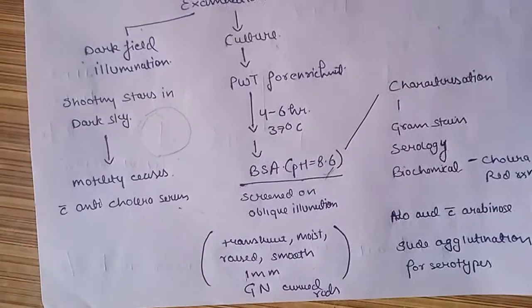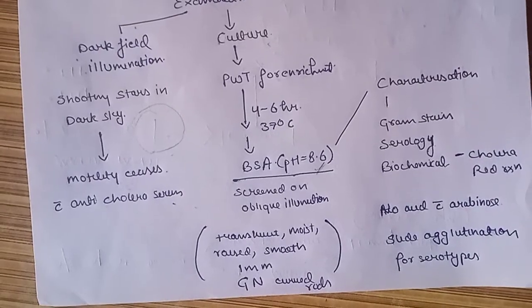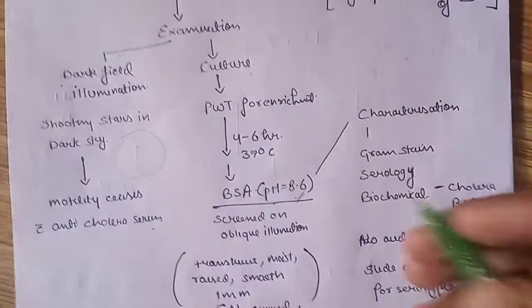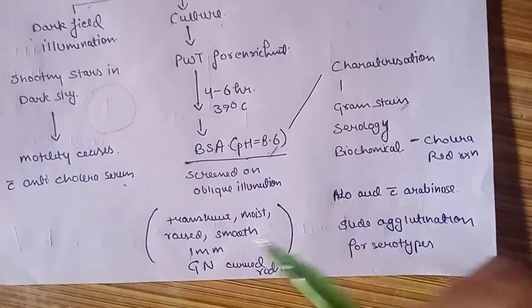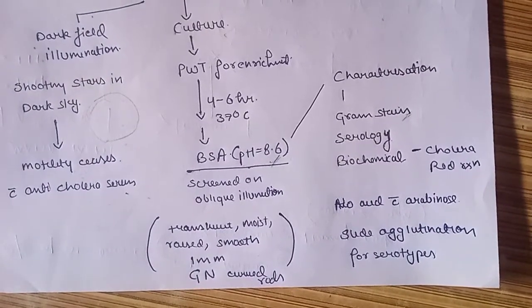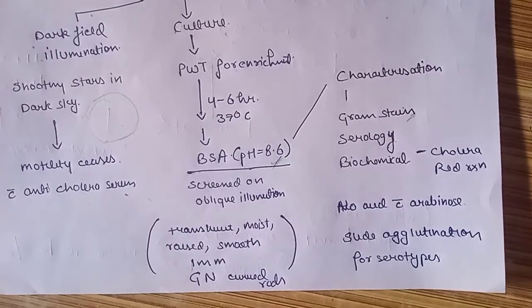Okay, and then we screen this sample from this bile salt agar into oblique illumination. Now, characterization of Vibrio can be done by many ways. Like when we see the gram stain, we see specific colonies that are translucent, moist, raised, 1 mm around in diameter, smooth, and we see gram negative curved rods.